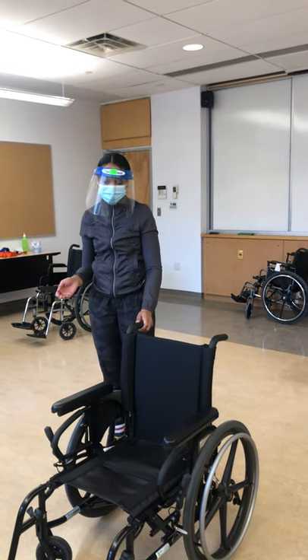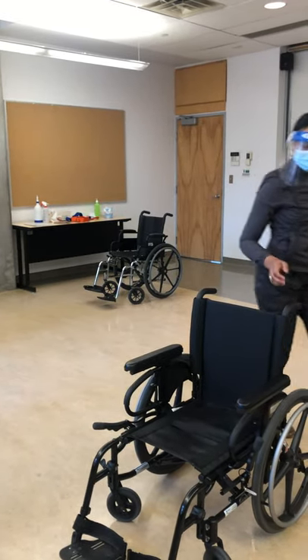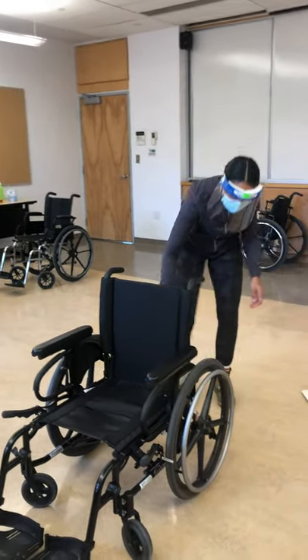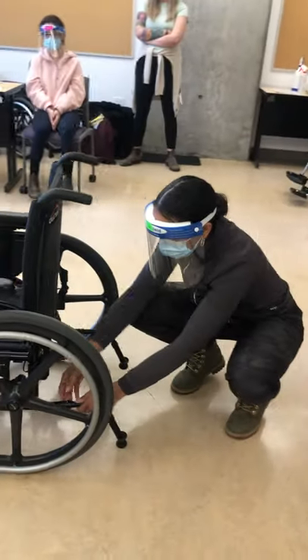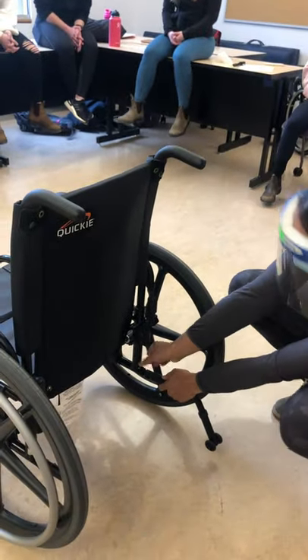I'm going to start by putting the brakes on, and then I'm going to remove the anti-tips from the back. There's a little metal button that you have to press and they slide off backwards.